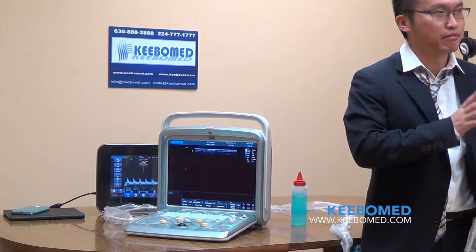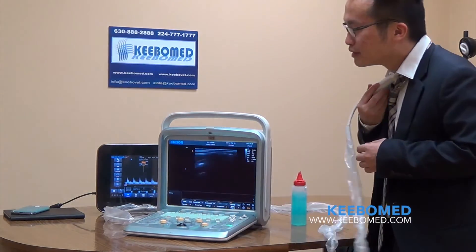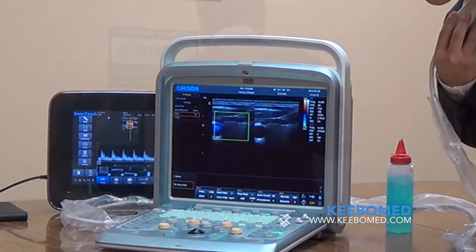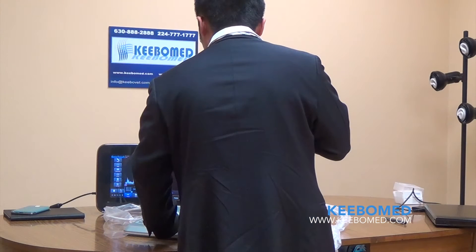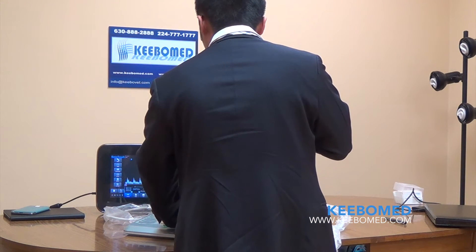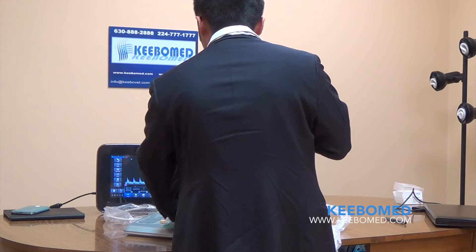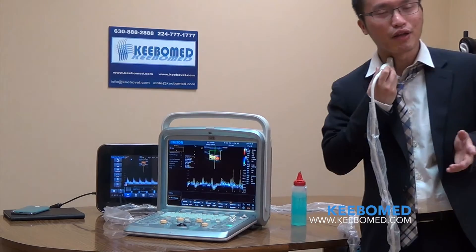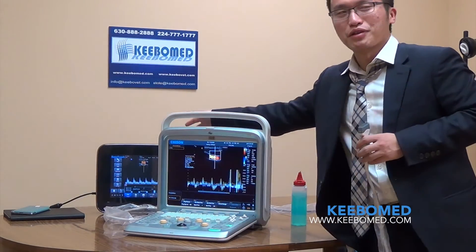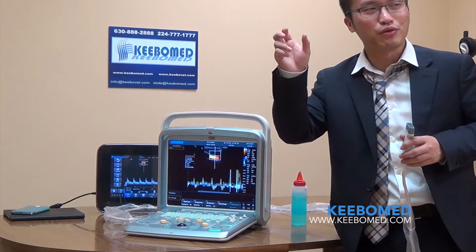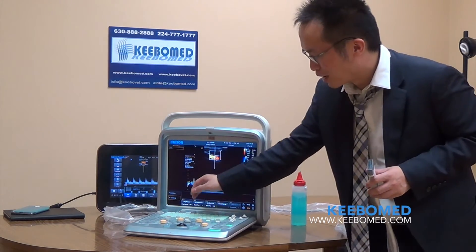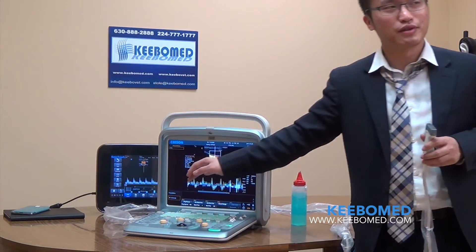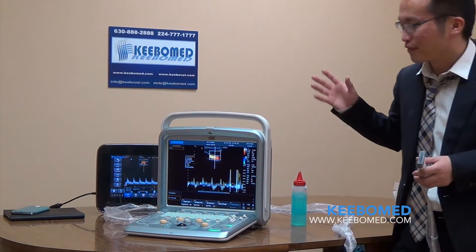We also have new features like BBC mode — B mode and color mode running in real time simultaneously. Unlike other ultrasound systems that require freezing first, on the Q9 you can perform measurements even in real time. This is another key feature of the Q9.